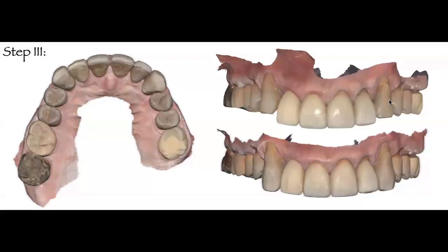And here is the pre-op scan. You can see how those canines were literally 2 to 3 millimeters shorter than the laterals and centrals. But after my prototypes, you can see how I was able to reestablish a new canine guidance using my composite resin.